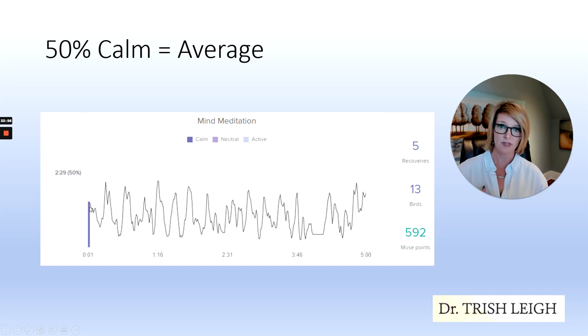And so when you have lower and flatter graphs with a higher percentage of calm and you can hold it there consistently, then you can add a minute to your training. Then you can add 2 minutes to your training. We want to see the brain come down and be reset, and then you can add more training. And here we have up and down push-ups with lower levels of calm, the brain hitting these lower levels. And here you can see a beautiful plateau.